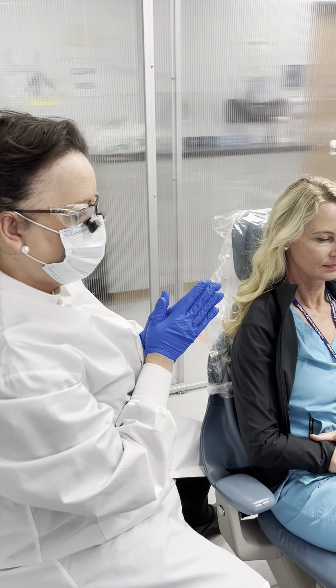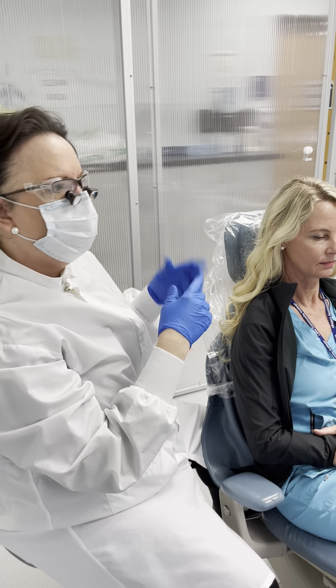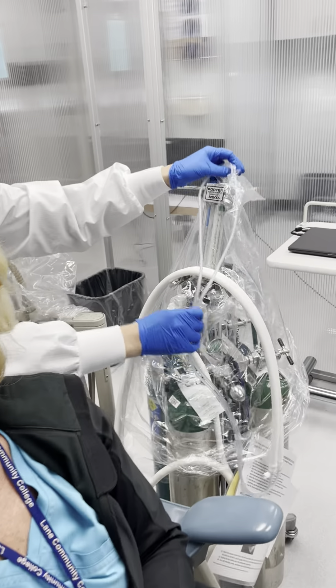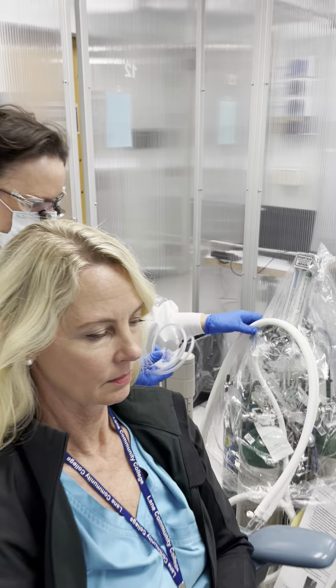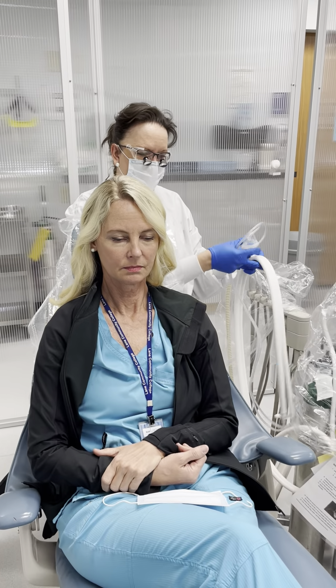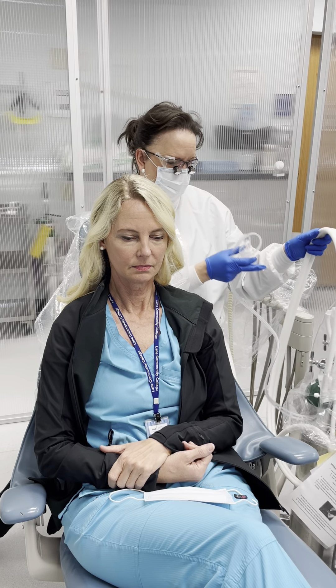We're going to show you how to do a nitrous induction with our new Silhouette nasal mask. I've already prepared the nitrous carriage, turned my units on, got my scavenger set, and already set according to this nasal mask.